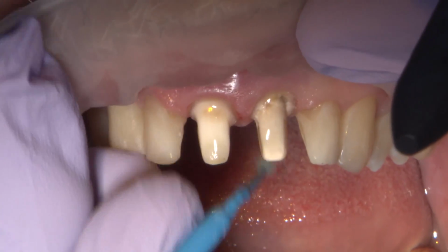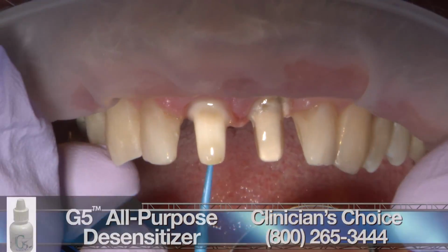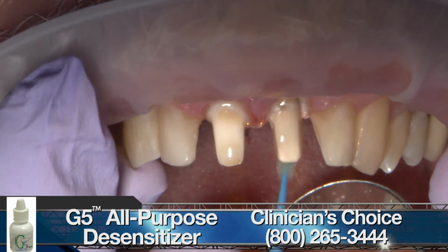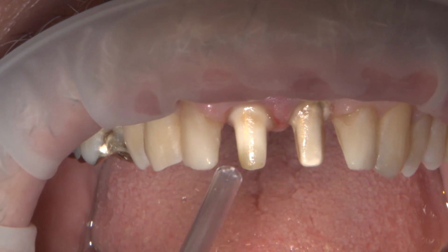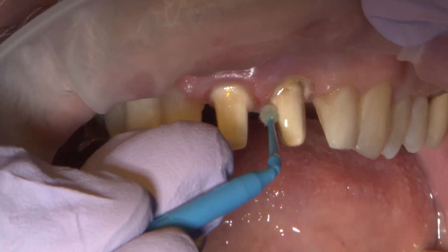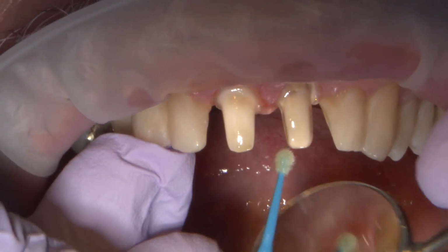Now we move on to the maxillary crowns, and we are going to bond these in as well. So we follow a similar sequence. Here I'm not going to total etch. We are going to use a self-adhesive resin cement. But I will apply a light layer of the G5 desensitizing agent and also a bonding agent and ensure that it's scrubbed really well into the dentin and all over the entire preparations.